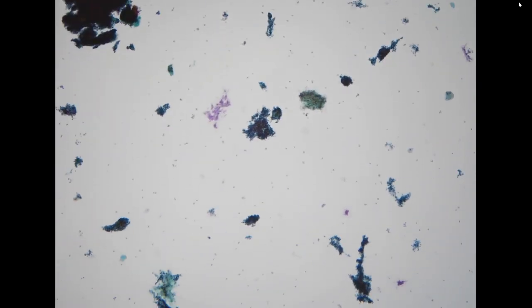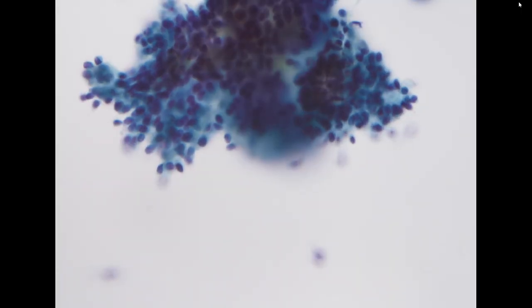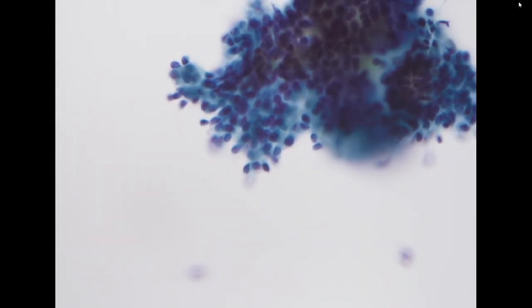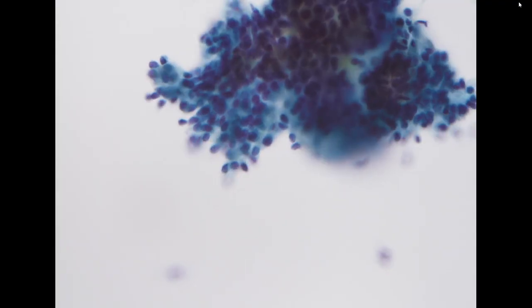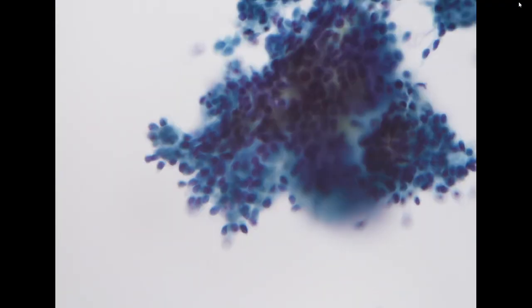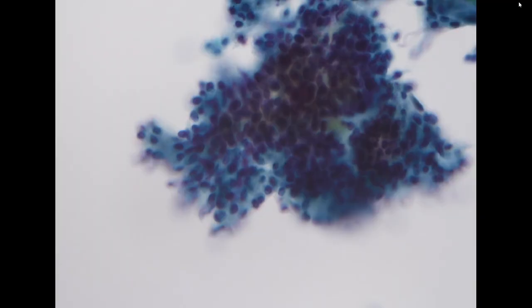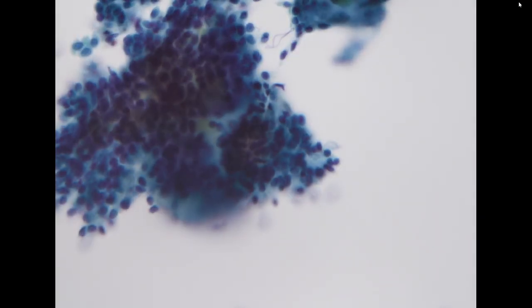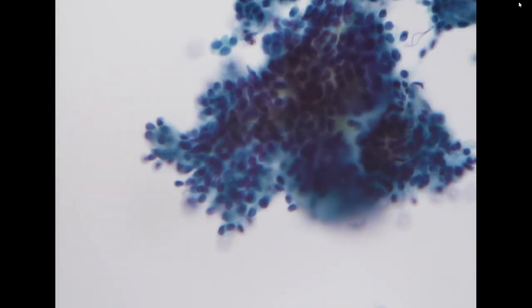We have some cellular clusters. The majority of the cells have an ovoid feature, a little bit spindle, a little bit ovoid. The nucleus is small and regular, so it looks benign. It has myoepithelial morphology because of these oval, kidney-shaped cells.